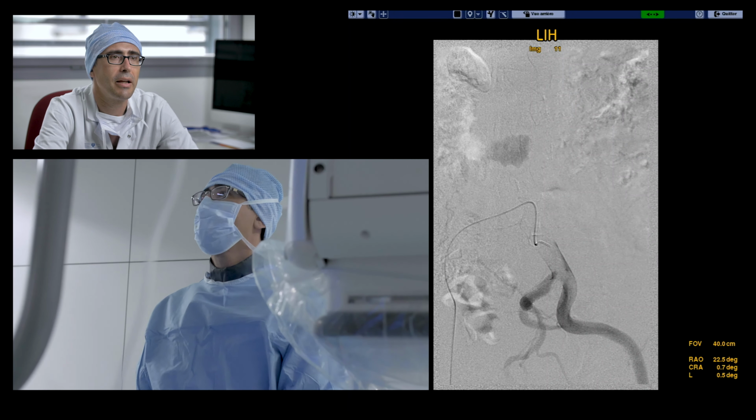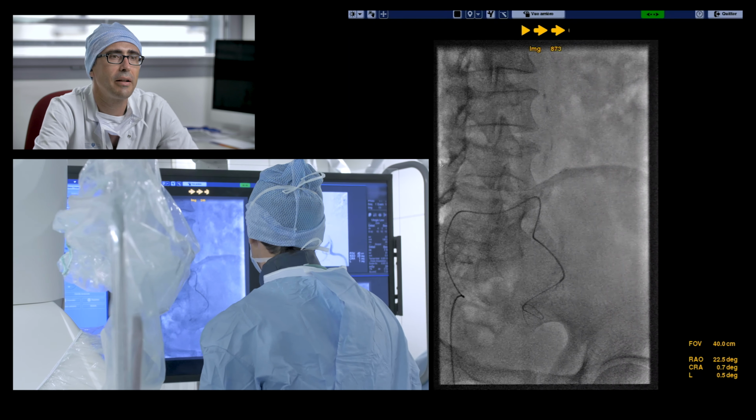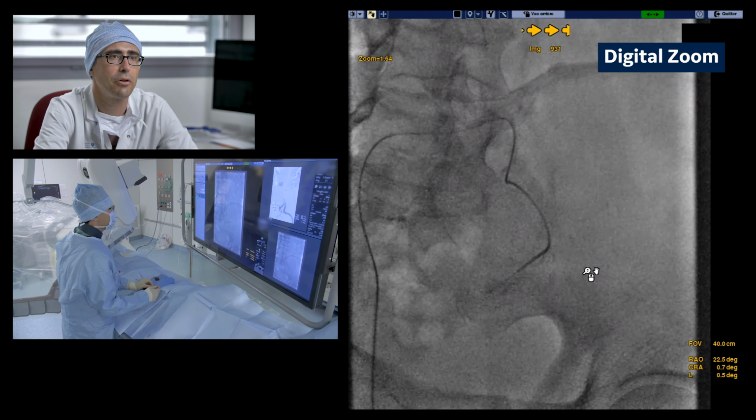Currently, the challenge with HBP embolisation is to be effective, firstly, and also to try to avoid complications. The reason is because the anatomy is quite complex, and there is also a lot of anastomosis from the prostatic arteries, and then we need accurate imaging software and hardware to guide the procedures.